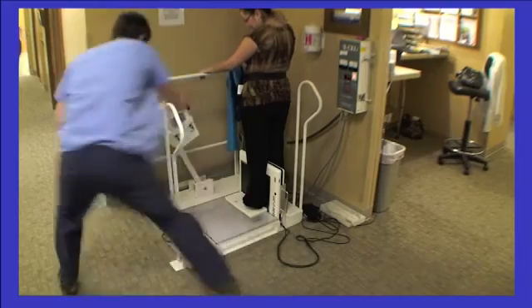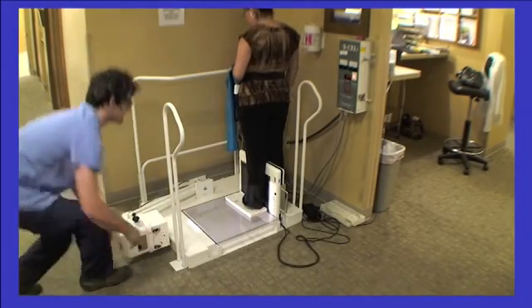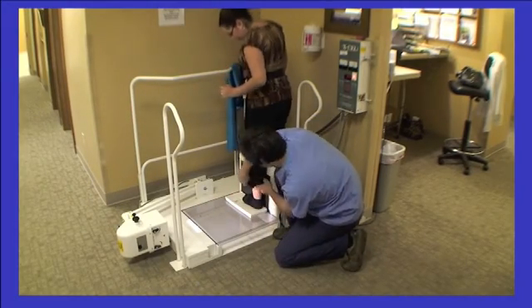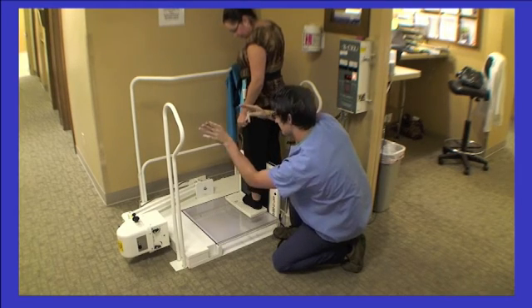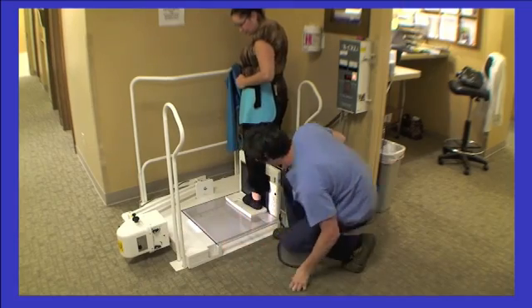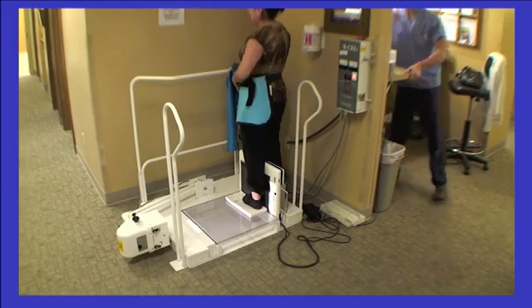When this is in place, you will make sure the head is tilted to 0 and then dropped completely to the left side and down as a normal lateral view is shot. Make sure the beam completely illuminates the cassette and the black circle is on the middle of the foot. You will then position the patient as before mentioned so you can gain access to their lateral foot and all of their ankle.